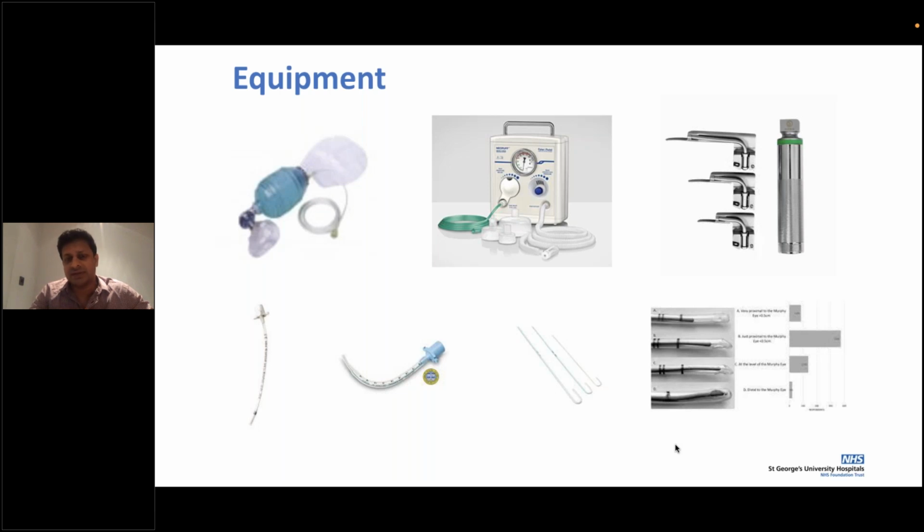Absolutely essential is to put your air flow up, and check what your PEEP pressures have been set at. If these are babies who have had some kind of ventilation support, they may not need as much high pressure. Ensuring there is a safety net, you may need just 20 or 25 of pressure. On the PEEP, your positive end expiratory pressure, it is absolutely key that it is not very high.